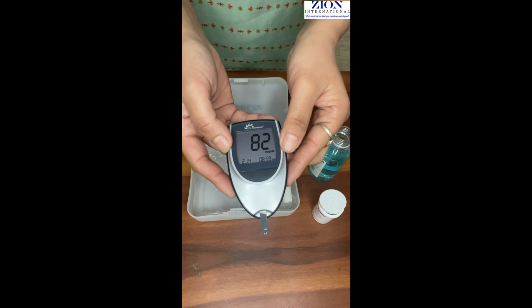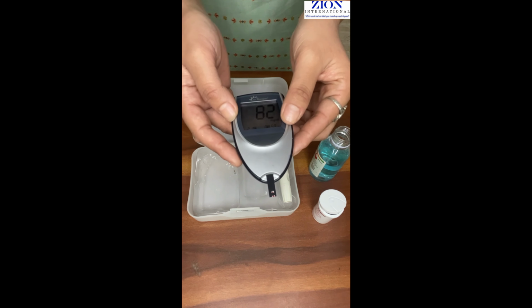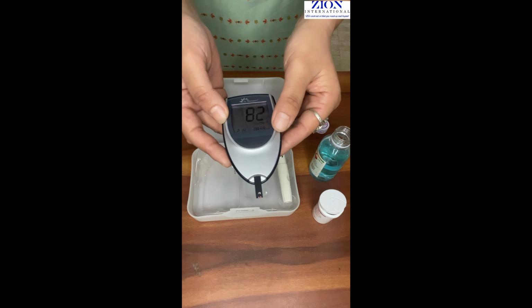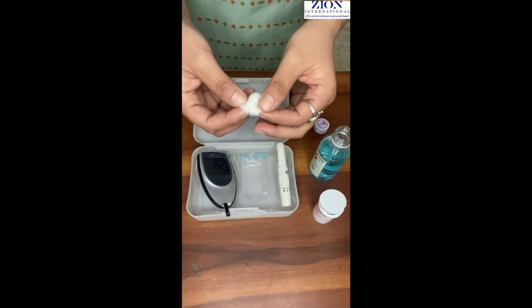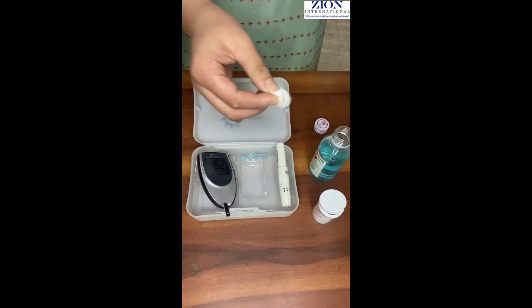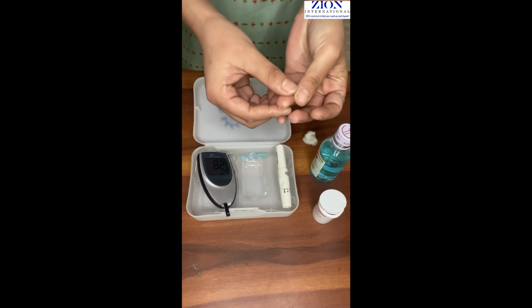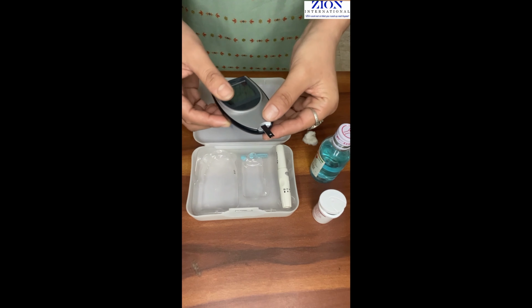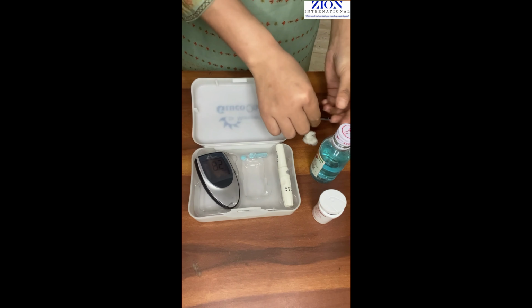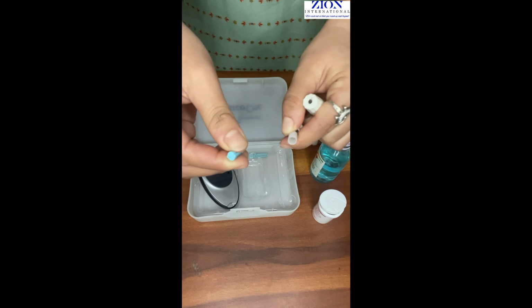So you can see the reading, it is 82, and 82 is a normal reading in fasting. So wipe the finger. Now our glucometer reading is done, sugar reading is done. Now we can wipe the finger with cotton and spirit solution and dispose of it. And also take out the Lancet pen needle from the Lancet pen, because this is only for one-time use. We cannot use it more than once.